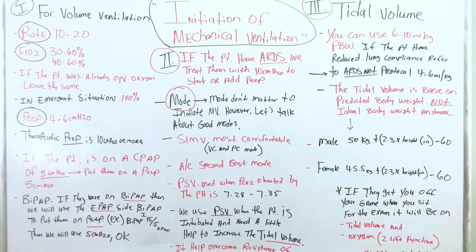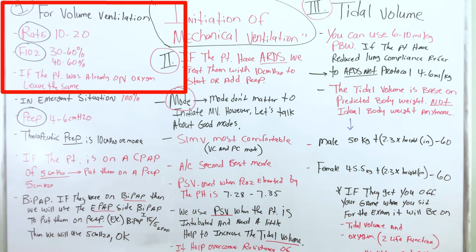Let's go. As far as I am concerned, initiation of mechanical ventilation is one of the bread and butter for any respiratory therapist. You have to know this information and you have to know it when you sit for the exam. Now, we're talking about the initiation of volume ventilation. We'll talk about pressure ventilation later because that's a whole different set of circumstances.